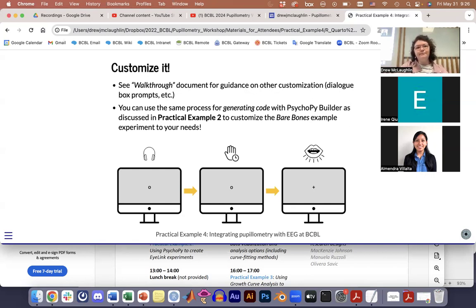Yeah, but the problem is that you have to find a way to literally align it, like Manu said, working as a channel, because you detect the artifact also with a visual inspection. So if you have it perfectly aligned, you have to be sure to delete the same part in the EEG and in the eye tracking part. If not, you will have a mess.